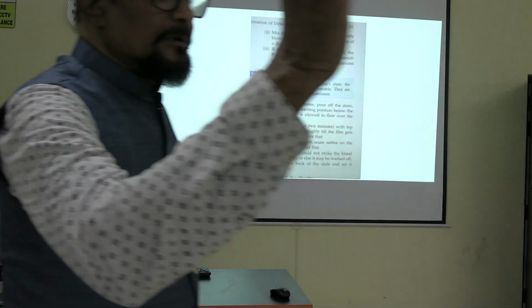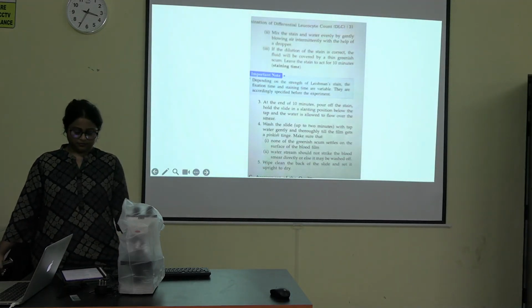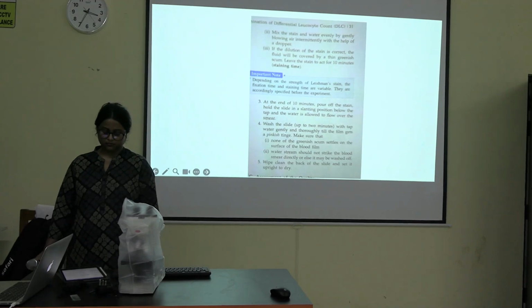How many drops of Leishman stain will you be giving? Then how much water? How much time do you need?